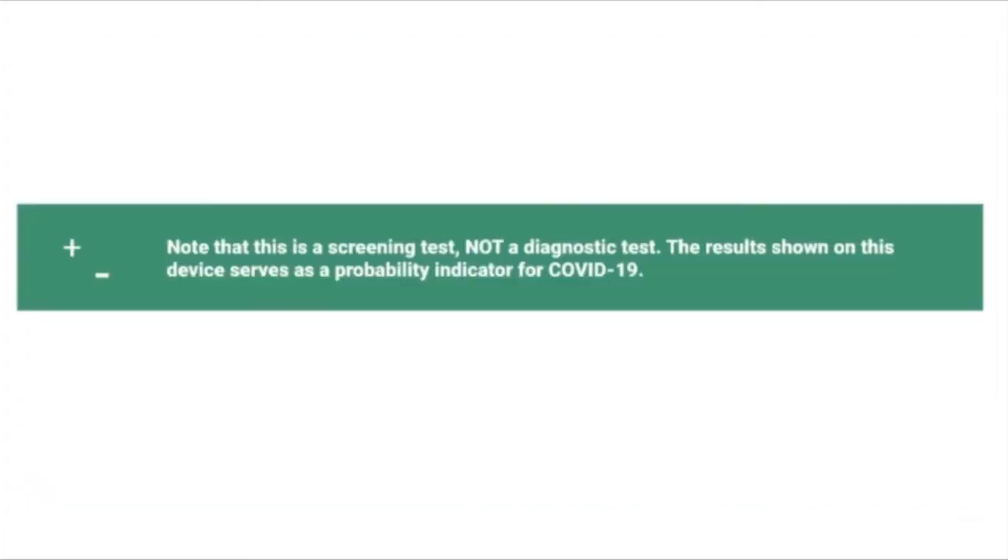It is important to note that this is a screening test and not a diagnostic test. The results shown on this device serve as a probability indicator for the detection of COVID-19.